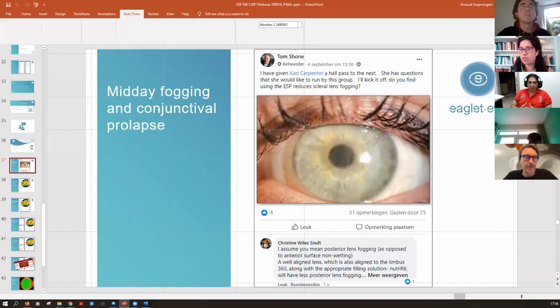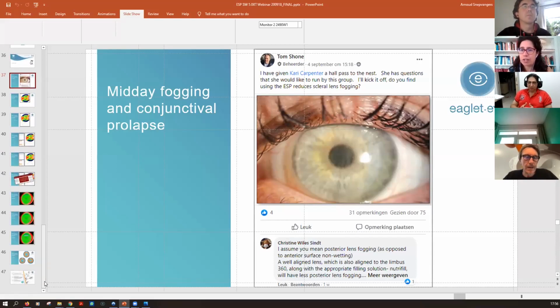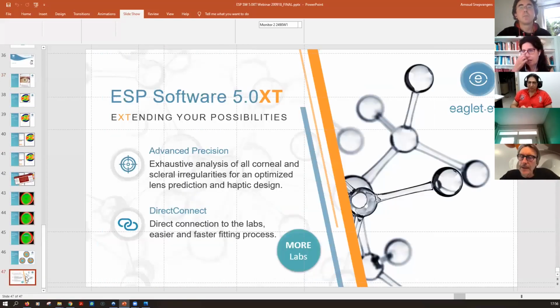So then there is a question about how many drops you are instilling into each eye. Generally a couple. And to be honest, you get to see what's working. I think it's useful to get the patient to blink a few times. It helps the anesthetic to dig in. So maybe 30 seconds, and you can count how many blinks in that 30 seconds. So a couple of drops, let it blink around.